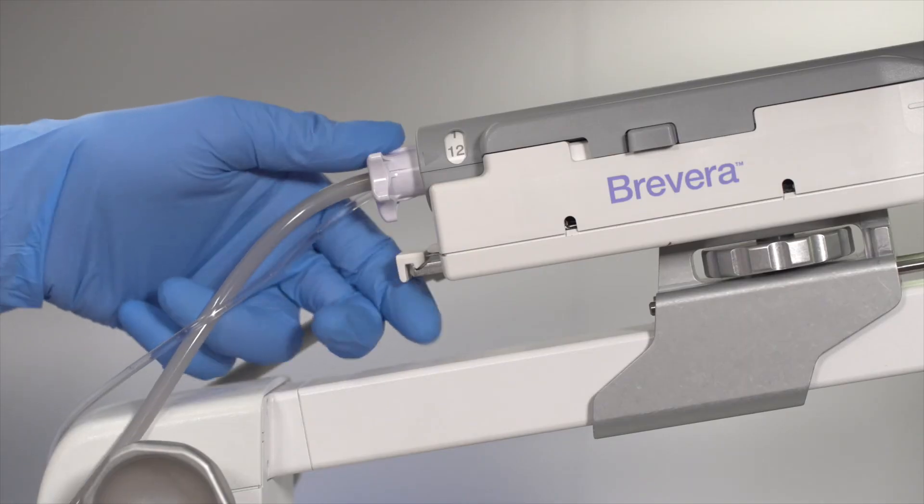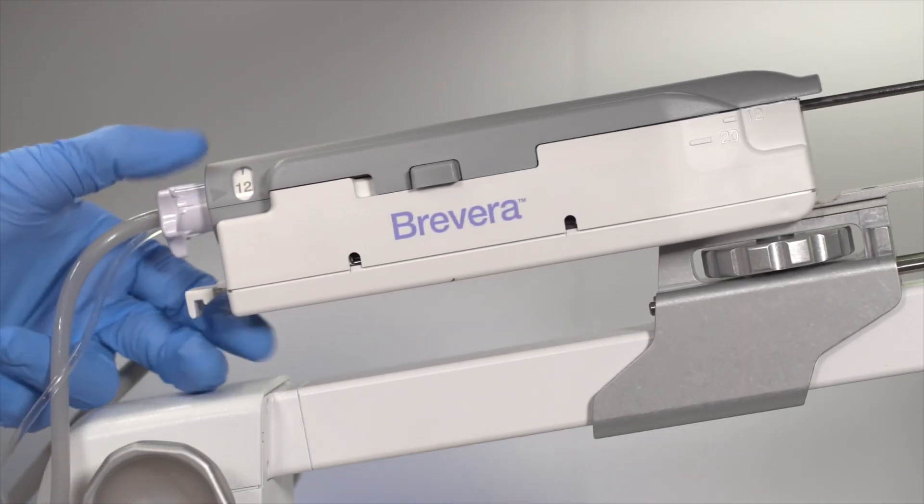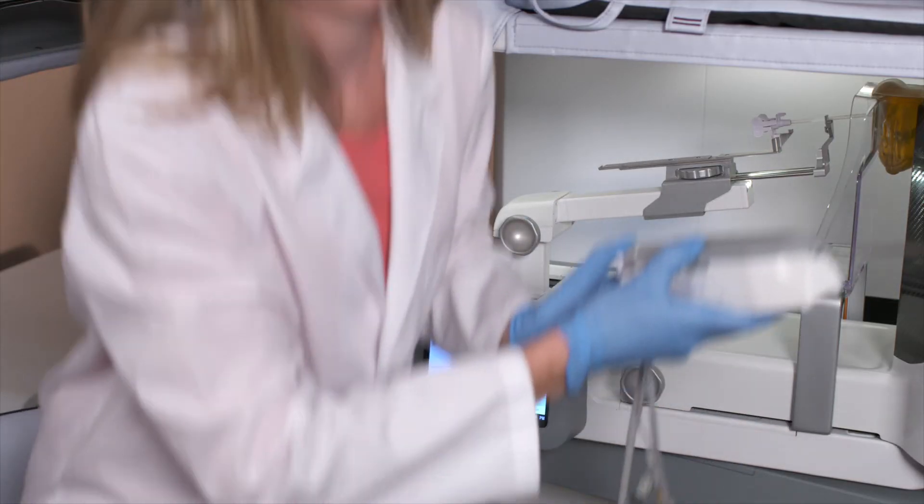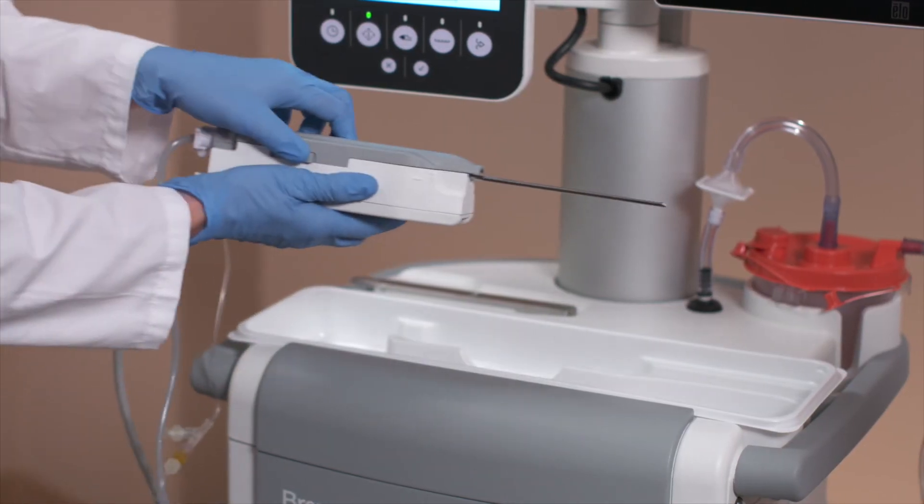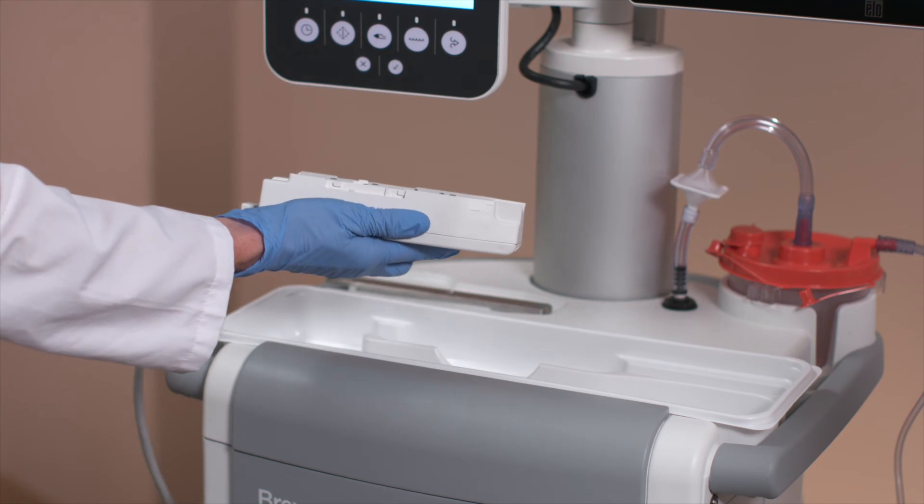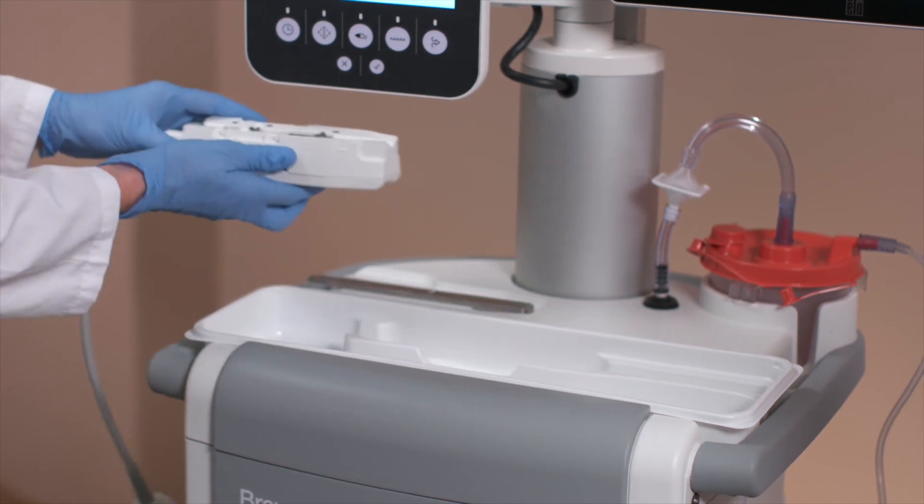To remove the needle, pull the tab at the back of the handpiece up and slide the biopsy device back, leaving the introducer in place. Carefully remove the biopsy needle from the driver by pinching the tabs to release. Dispose of the biopsy needle in the sharps container.